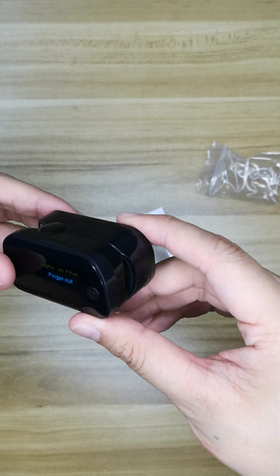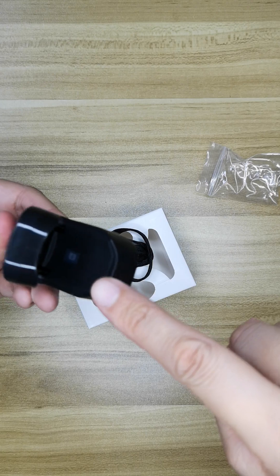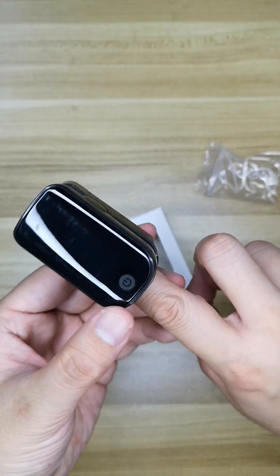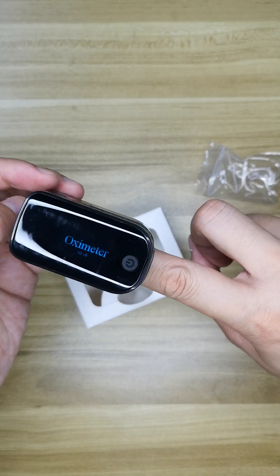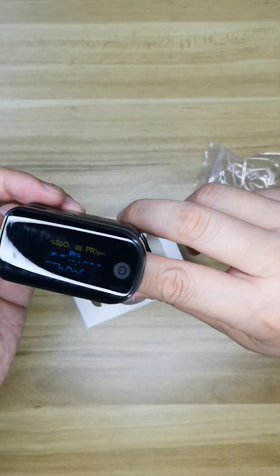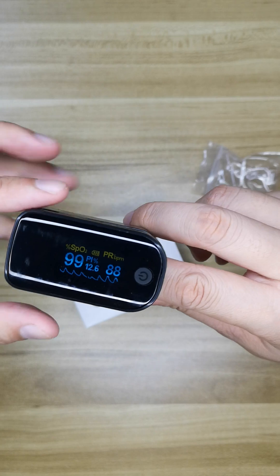What we are doing now is to pinch it out, then open it and insert our finger and hit power on. And you can see the screen will show the meter numbers.